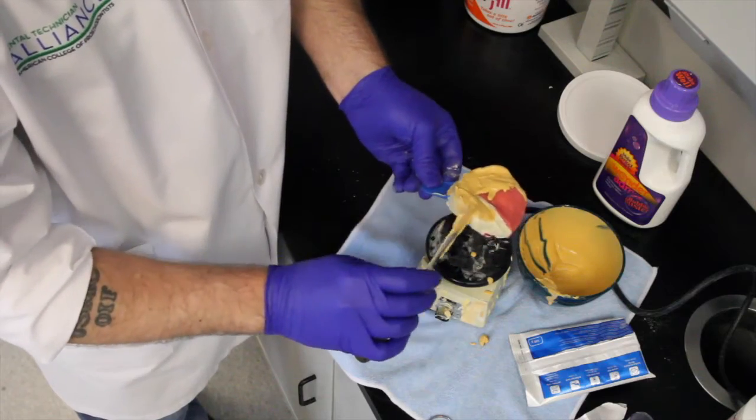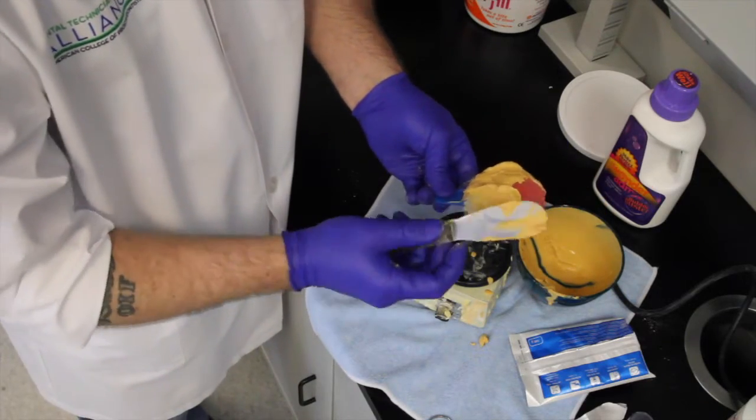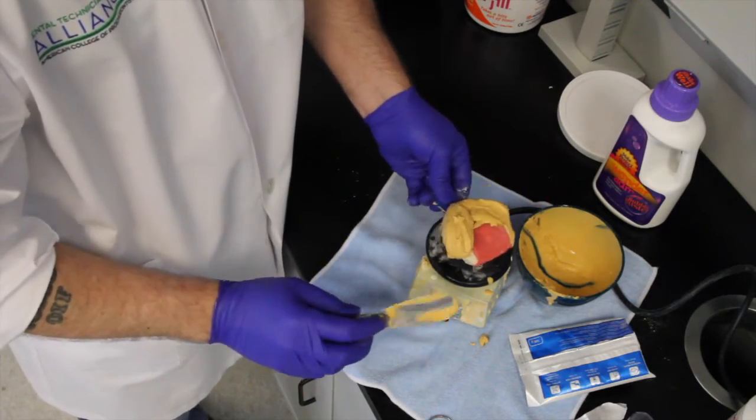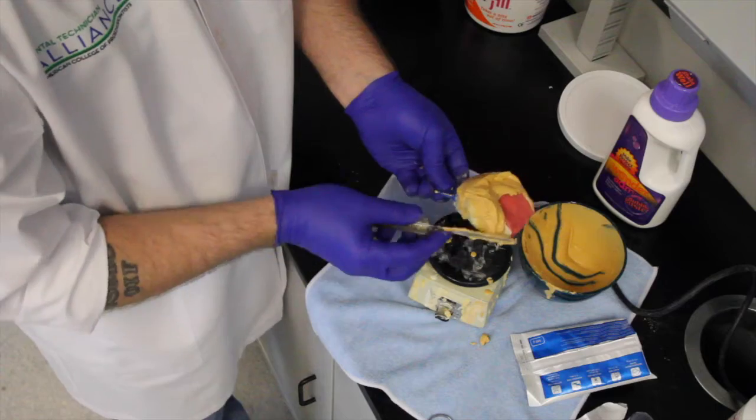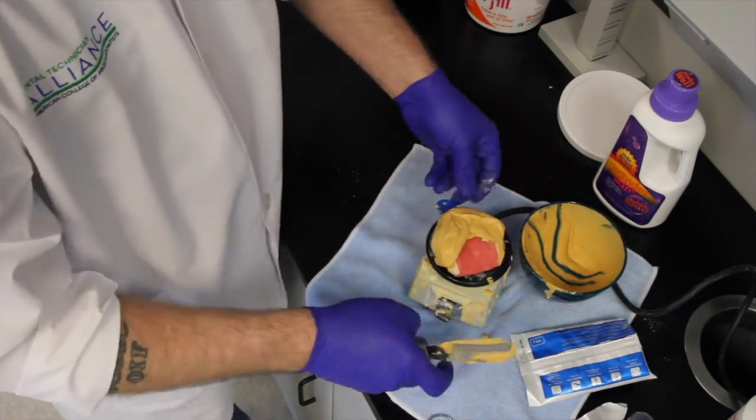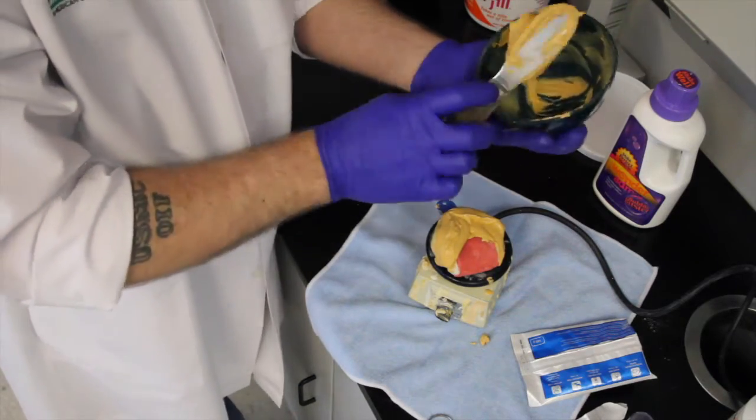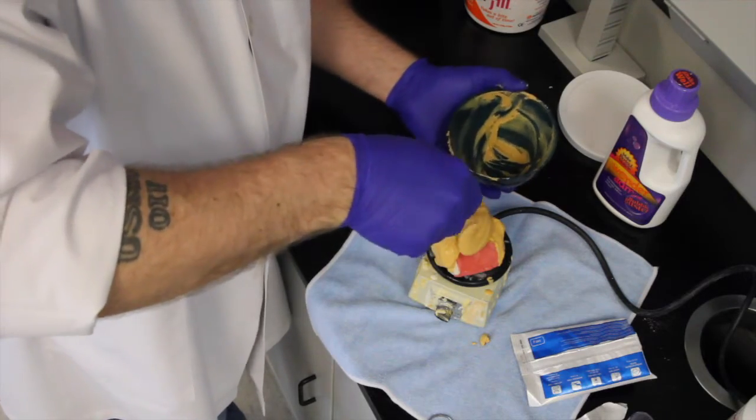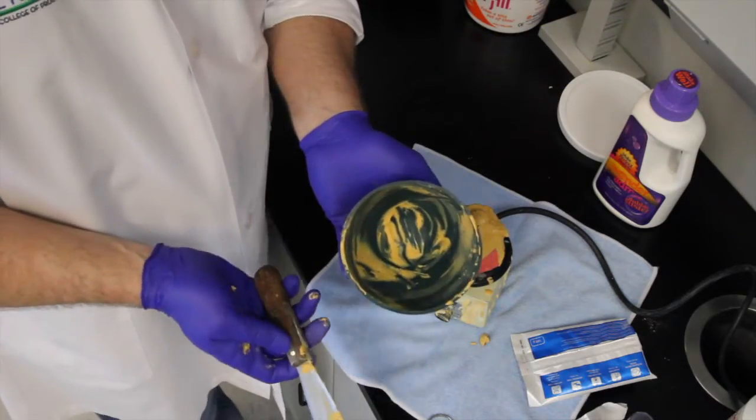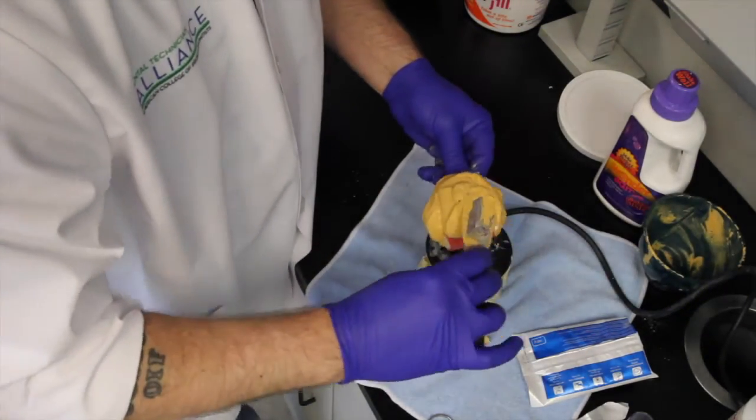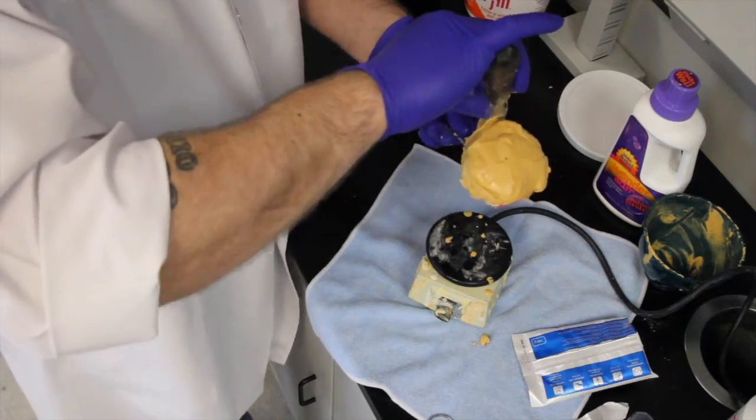From here we're just going to add on this side because we already have the teeth covered. Just going to fill the rest of it in. I'm going to take the rest of the product out of the bowl and put it right there. That's where that tongue space is going to be really nice and hold it for us. Look at all the product is used. There's no waste. Now I'm just going to spatulate it up the retromolar pad. Just keep it on the impression so we don't lock it in.